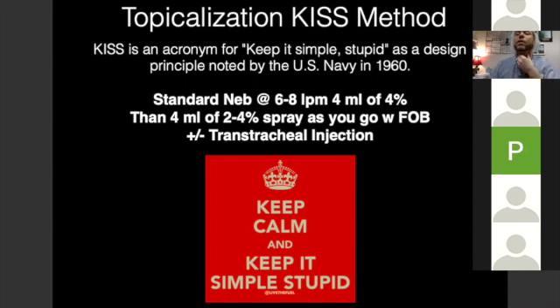You feel the thyroid cartilage, the big one. You walk off it into the cricothyroid membrane. You put your needle through. And what needle is that? You can grab an angiocath. You can grab a 20 gauge angiocath. You can put the angiocath on a 10 cc empty syringe. I'm sorry, with a few cc's of saline.